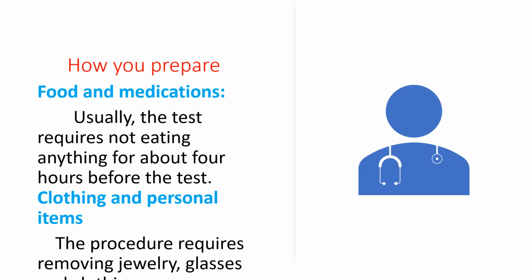So how do we prepare for coronary angiography? Mainly food and medications should be withheld at least 4 hours prior to the test, and we have to remove clothing and jewelry before the procedure.